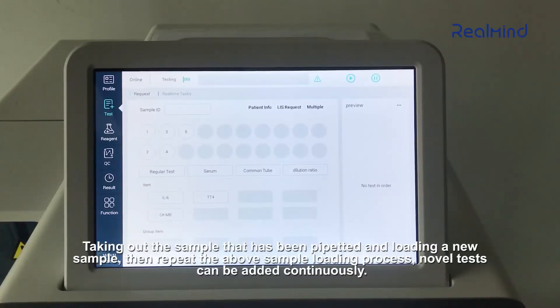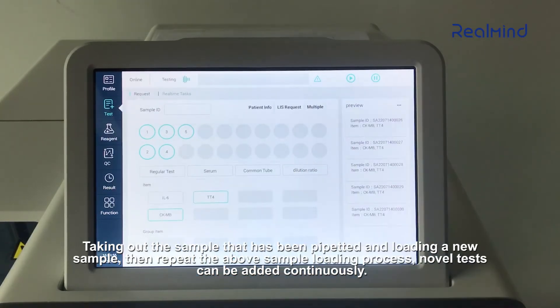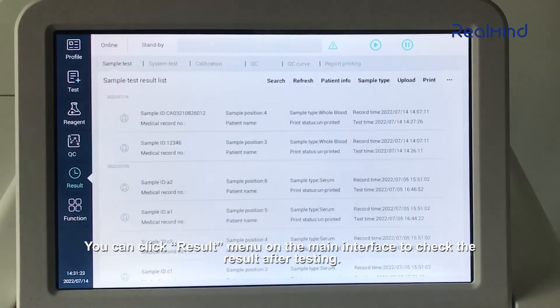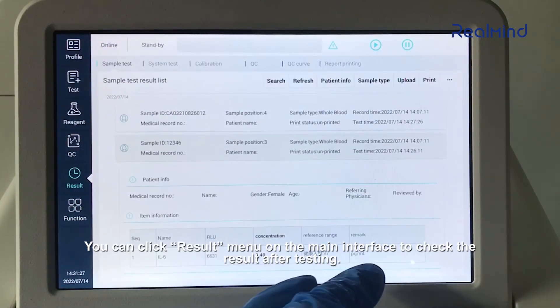Take out the sample that has been pipetted and load a new sample, then repeat the above sample loading process. Novel tests can be added continuously. You can click the result menu on the main interface to check results after testing.